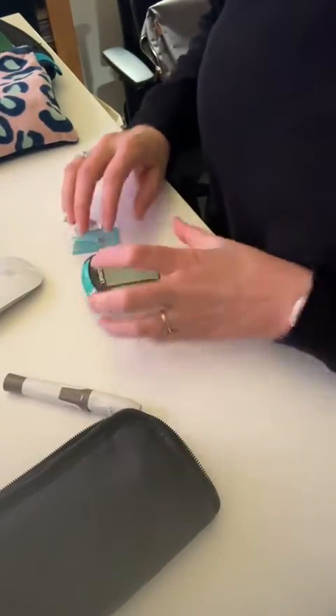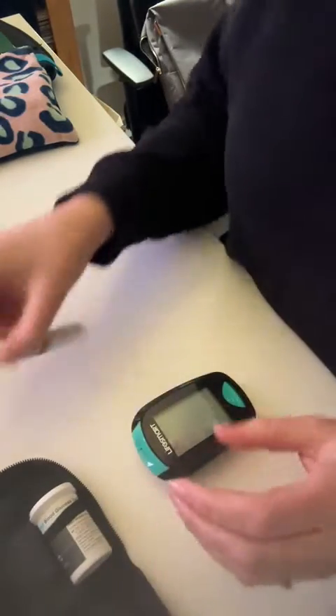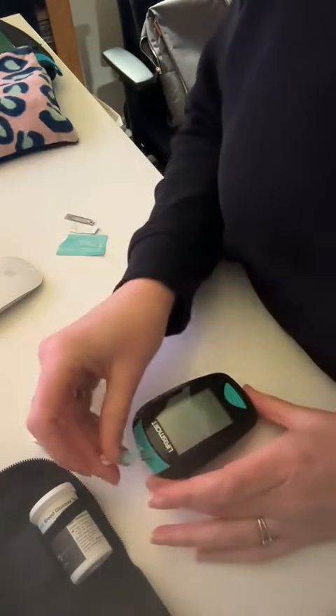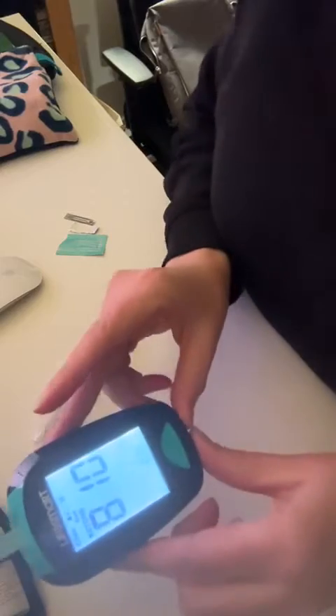This is the process I go through when I'm taking my GKI. I have a little bag — the LifeSmart bag — with my machine and my lancet. I always start with the ketone strip, plug it in, making sure that the channel actually says ketone.